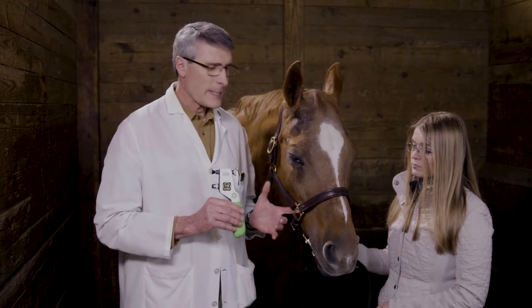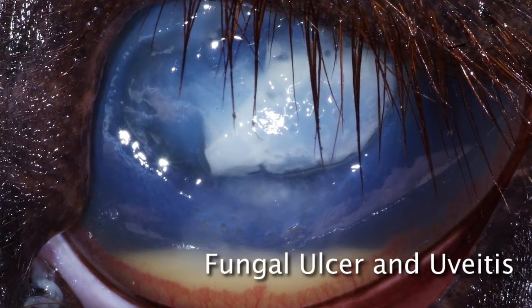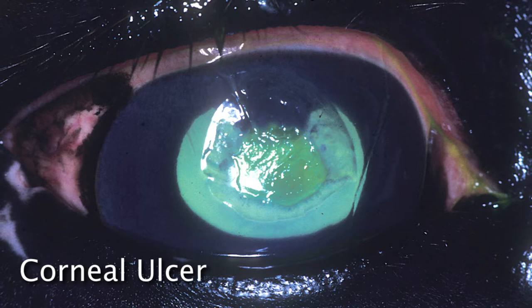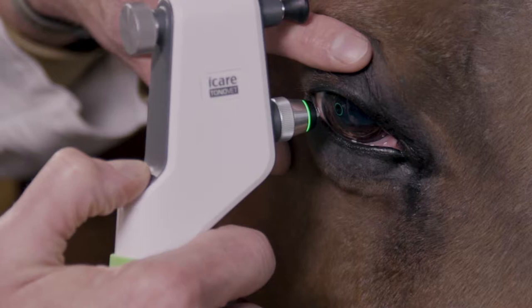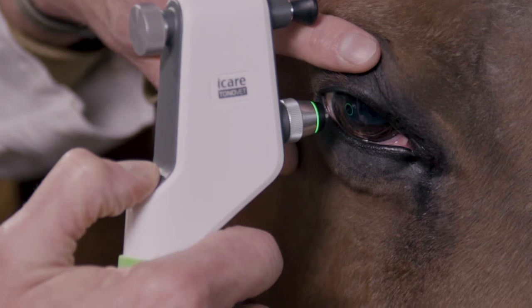There are a number of things that can alter intraocular pressure in the horse. Decreased intraocular pressure is usually secondary to inflammation in the eye. Horses that have equine recurrent uveitis, or uveitis associated with surface ocular irritation such as a corneal ulcer, corneal foreign body, or stromal abscess — these horses' intraocular pressures can sometimes be less than 10. Now that we have the capability of surgically and medically treating equine recurrent uveitis, early diagnosis with tonometry and intraocular pressure support of a diagnosis is very, very important.